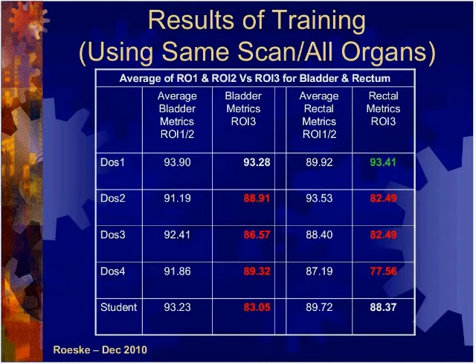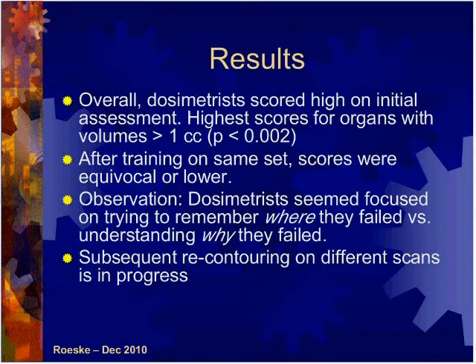Why have them retested? But the second issue, and it gets a little bit into human psychology, is that as someone is looking through the scans, maybe they're trying to memorize where the gold contours were versus trying to understand how their contours differed anatomically from what the physicians drew as the gold contours. So that's an area that certainly needs a little bit of work in the future as one wants to try to establish this type of program.